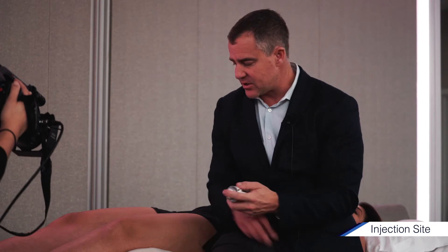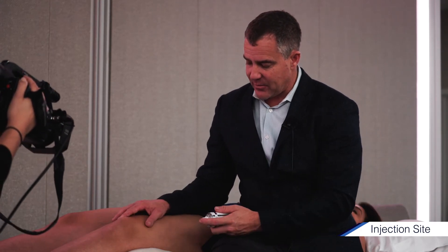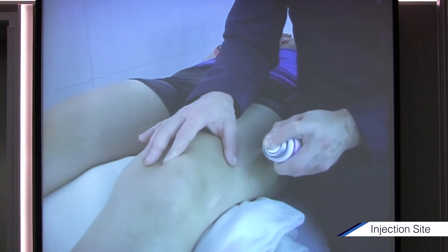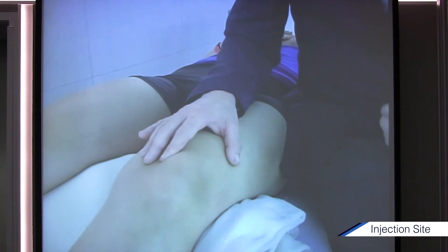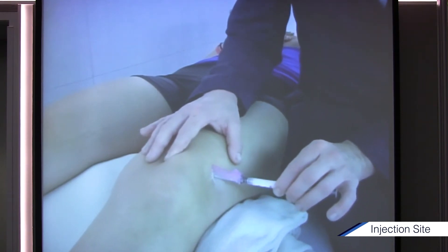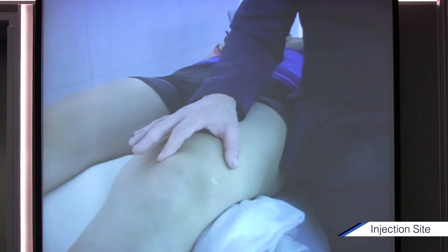Then I take either ethyl chloride or this mist-spray ethyl chloride — it comes in a directed stream or a broader spray. I keep it about six inches away from the landmark and spray until it looks cold and frosty. Then I just poke right in. What you usually feel is two things: the skin, and then it going through the capsule. If they're going to shriek, it's going to be at the capsule, because the capsule — especially in an inflamed knee — is going to hurt a little bit.